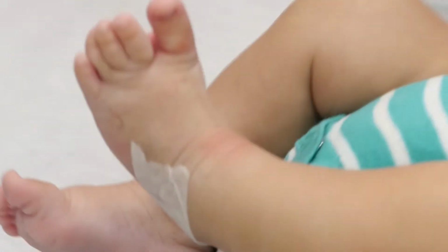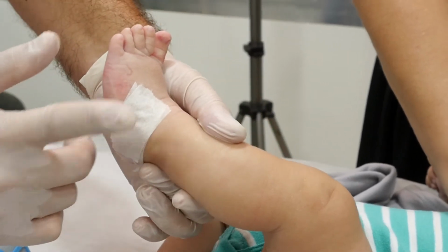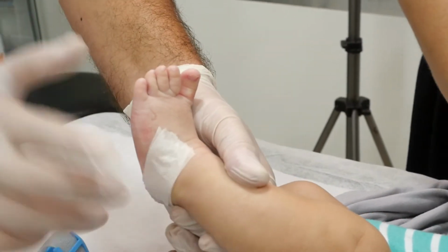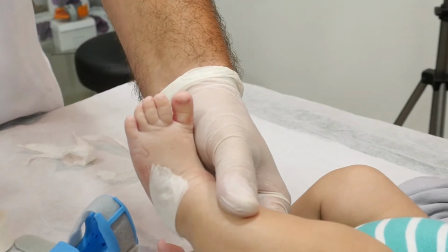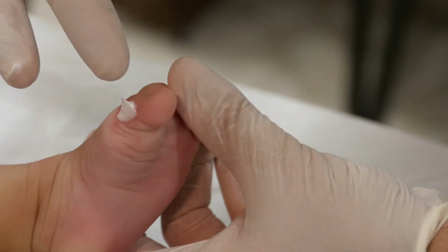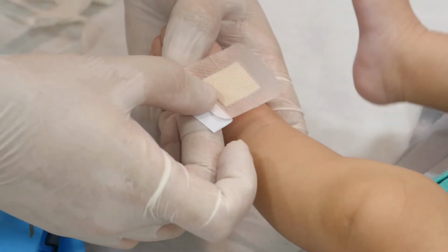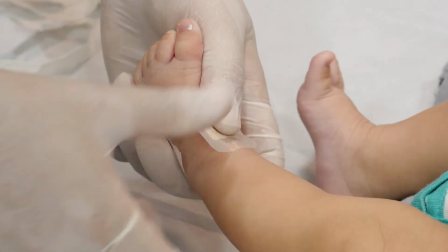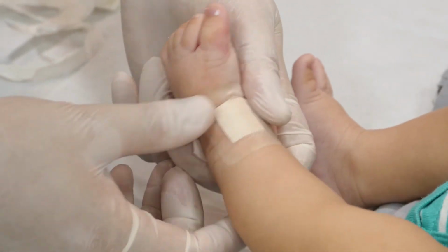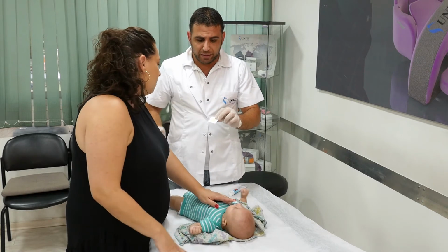If bed sores or blisters appear on the baby's foot, a problem that occurs mostly due to over-tightening of the strap or improper setup, then therapy must be stopped for about 2 hours. Anti-irritation cream for the skin should be applied on the area, and then the area should be covered with a Band-Aid. After 2 hours, therapy should be continued regularly. If things get worse, consult your therapist.